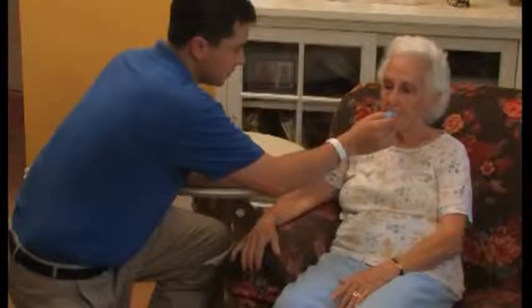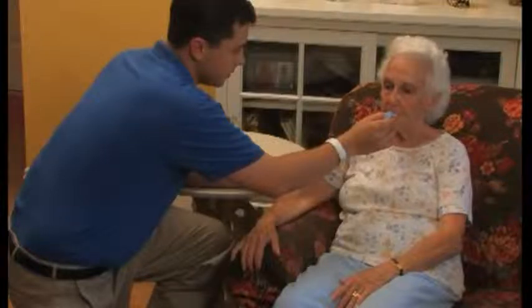Now, it's important to never measure the severity of the illness based solely upon the temperature reading. For example, influenza may cause the temperature to spike upwards of 104 degrees. Yet a resident could have a severe pneumonia and only have a slightly elevated temperature. That's why it's important for us to take the temperature reading and report it to the physician for analysis.